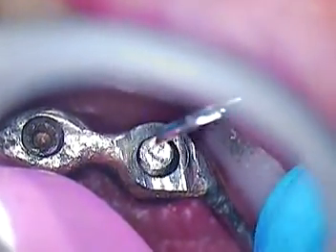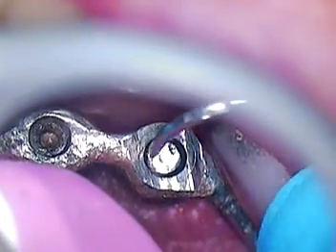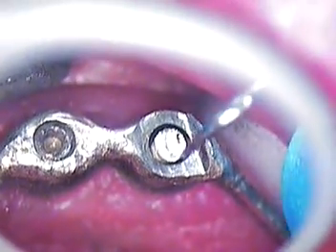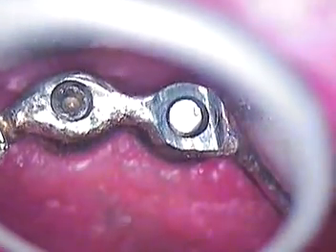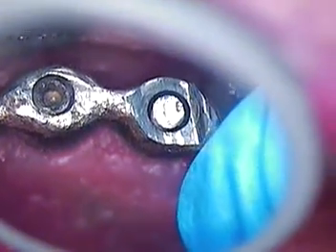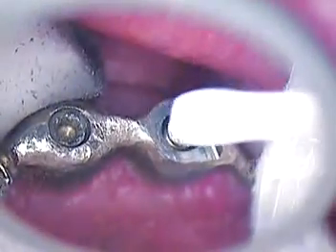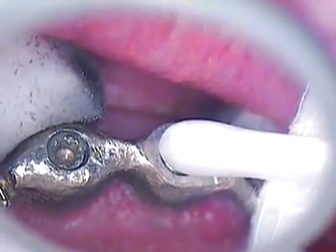Now what we'll do is we'll take a little, it's like a Q-tip of wax. We call it a pick and stick. And we just go in there, and now we know it's ready to go. But we want to drape a 2x2 underneath. So a 2x2 gauze. Okay. Here comes the gauze. And out it comes. We'll take a look at that screw.